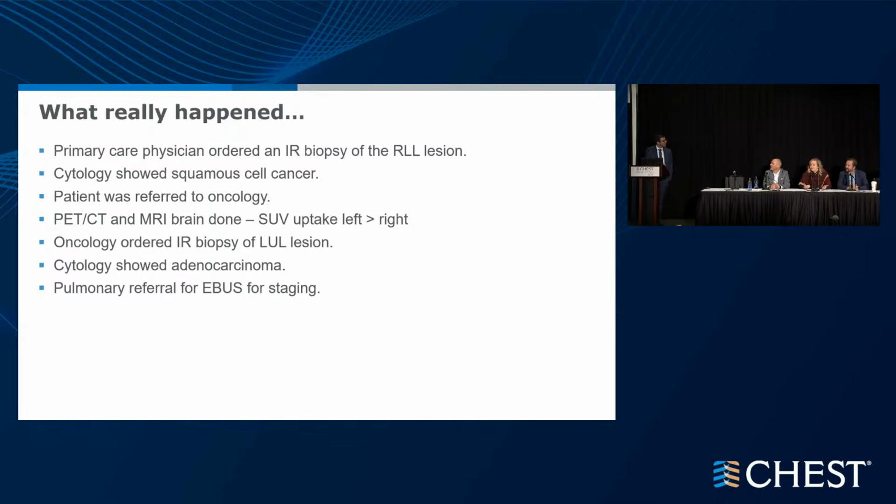And the other thing I'd make a point of, it's kind of an observation, is that the scan that we saw was a non-contrast CT. Yes. And just for all the fellows and folks out there, ideally, if you're really going to call the mediastinum in a methodical way, a priori before a procedure, it's ideal to have a CT with contrast, just so you can be prepared. Even though you're going to do a survey with EBUS regardless, that's the information you'd like to look at, just to be more certain.